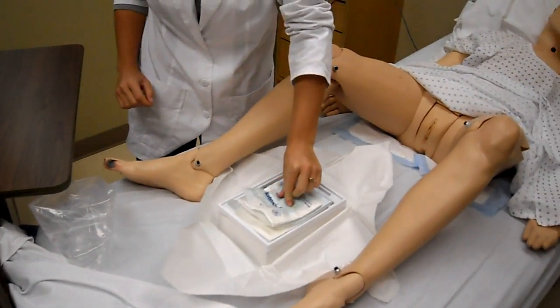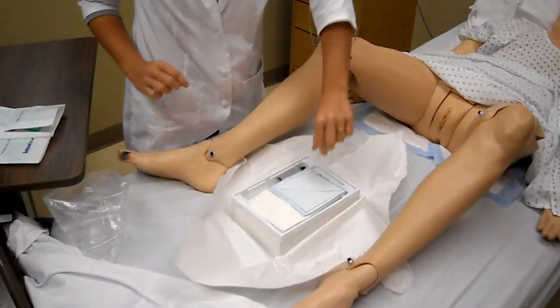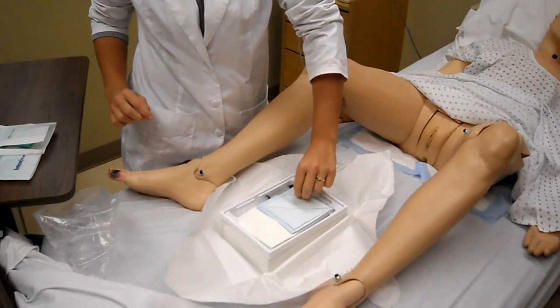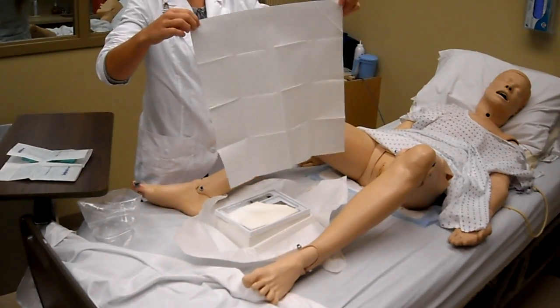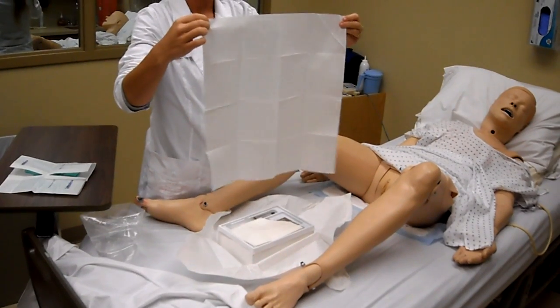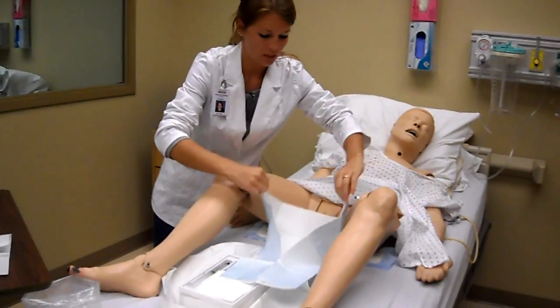Then you're going to take your sterile gloves out and set those aside. Then you're going to take your draping — grab it by the corner only. Shake it out so the glossy side is facing you, then fold it and drape the patient.